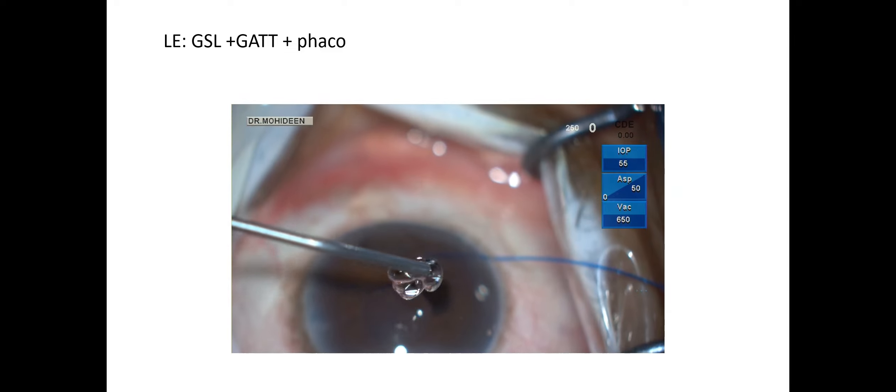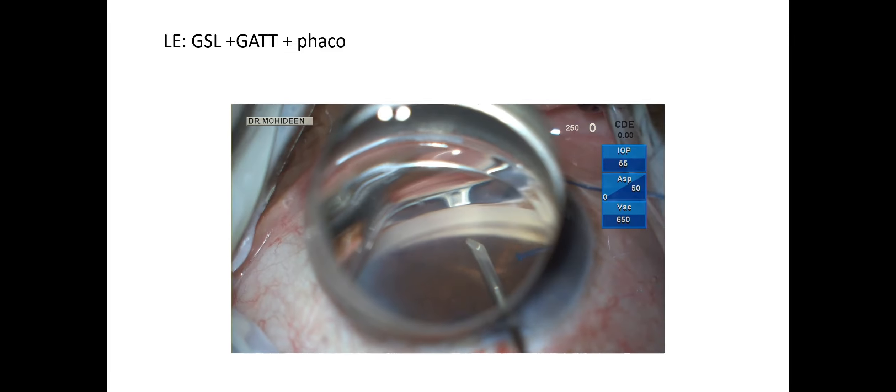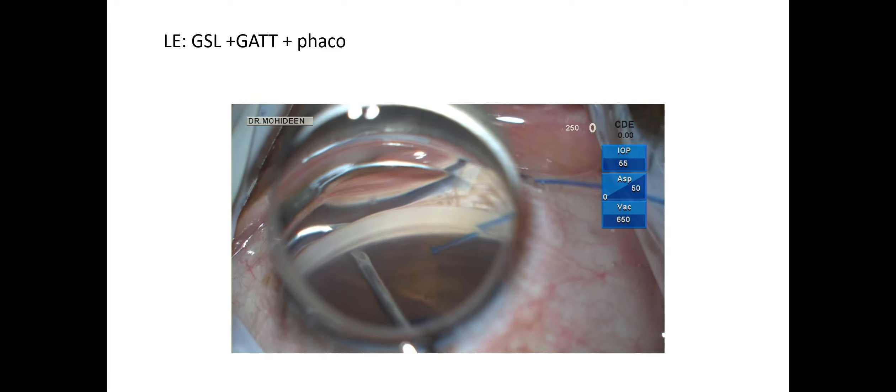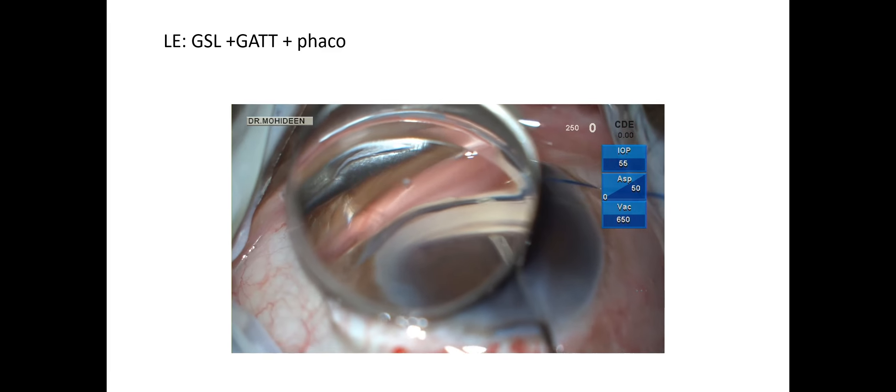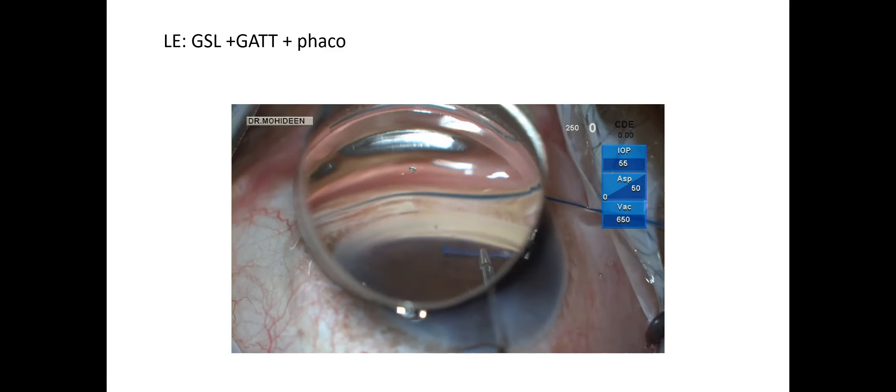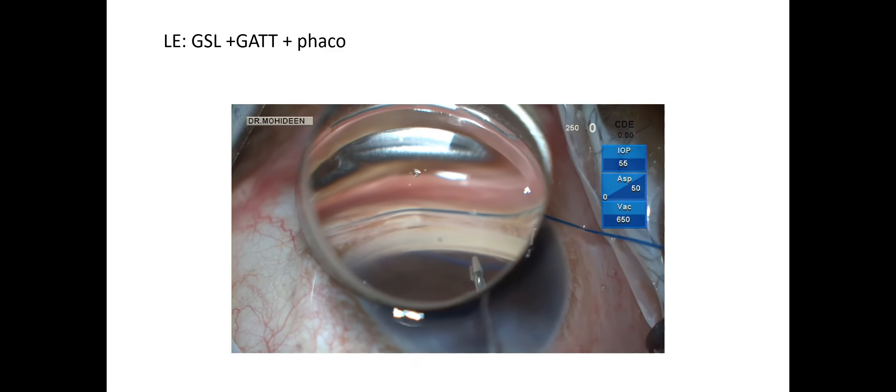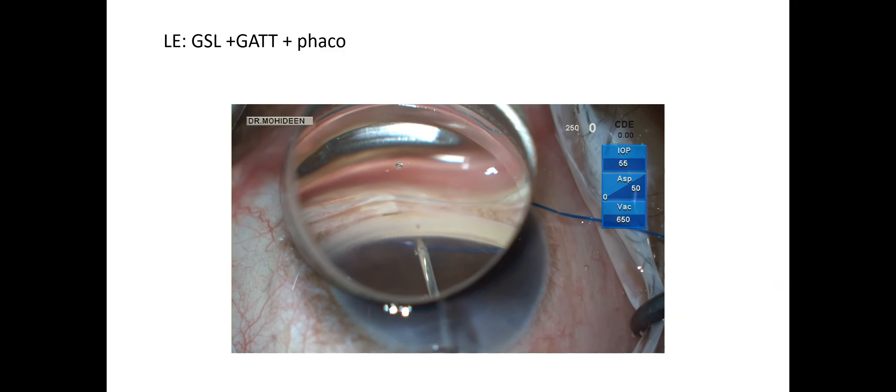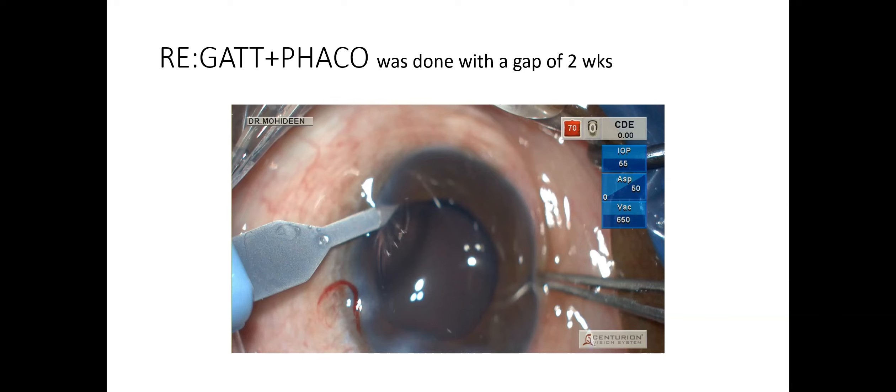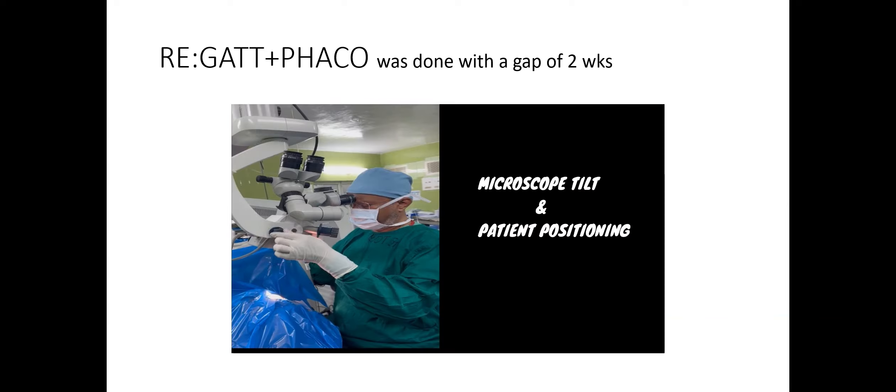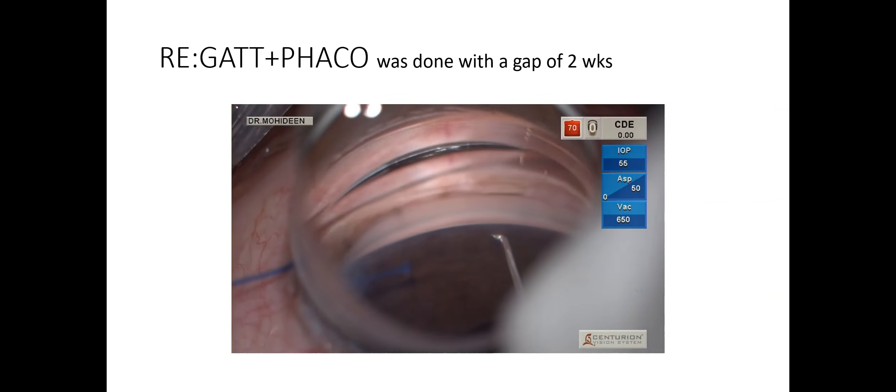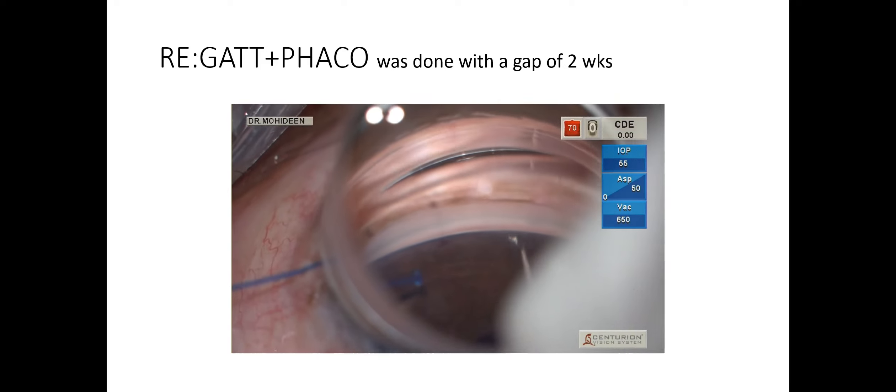The Tanito microhook is introduced through the paracentesis and gentle goniosynechiolysis is performed. After achieving goniosynechiolysis, the blunted prolene tip is introduced and goniotomy is done. Schlemm's canal is exposed in the nasal quadrant and the prolene suture is threaded and the procedure is performed. The same patient underwent GATT with phacoemulsification within a gap of two weeks. The microscope tilt and patient positioning are key factors for successful GATT.